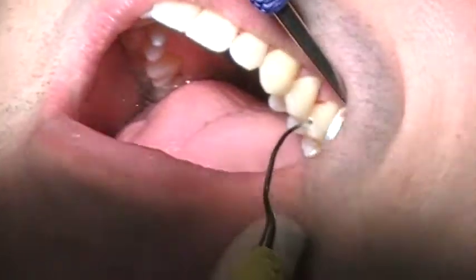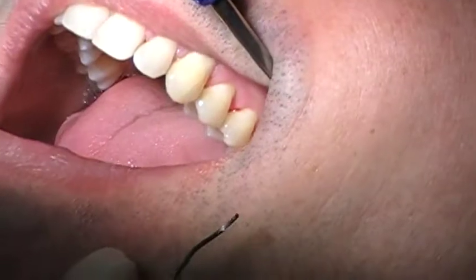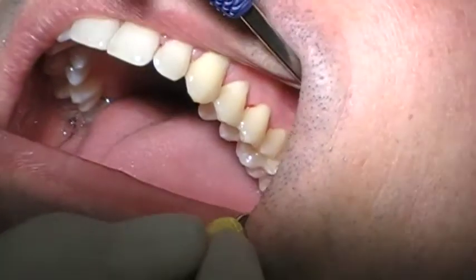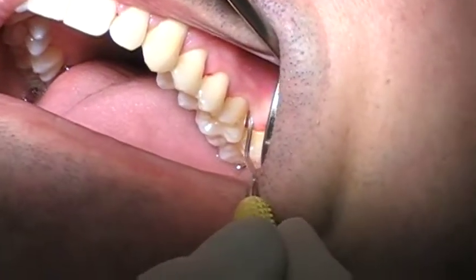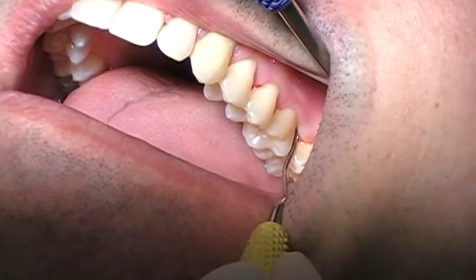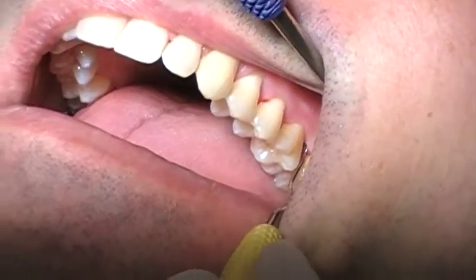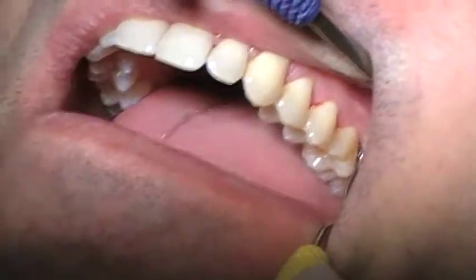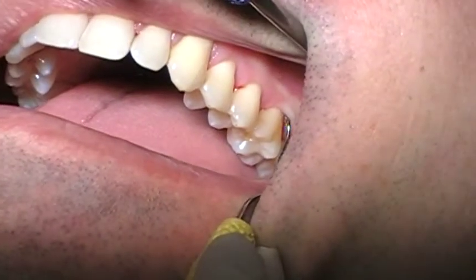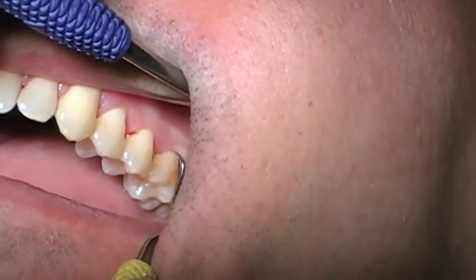I'm going to have my patient turn just a little bit here, and I'm going to put the mirror in there to flashlight-effect it. You insert at the distal line angle, at zero degrees at the distal line angle. I'm using an extraoral fulcrum so my hand won't block my light, and I'm going to go ahead and instrumentate the whole buccal of this area, keeping that toe one-third adapted to the root.